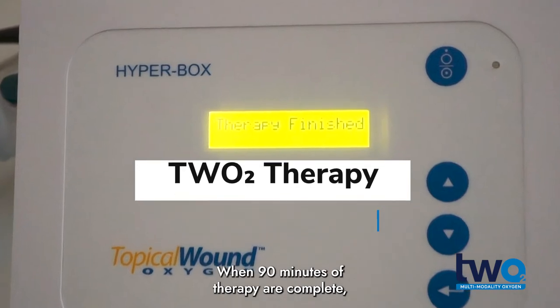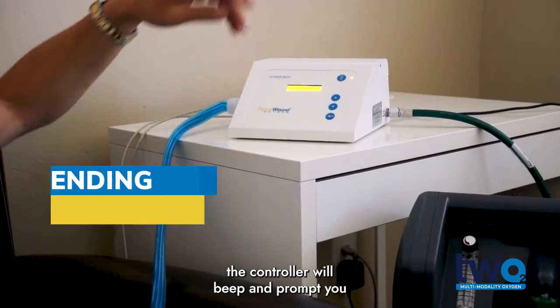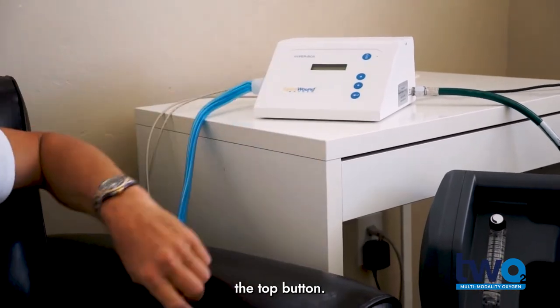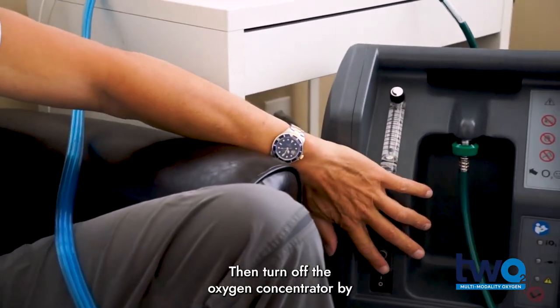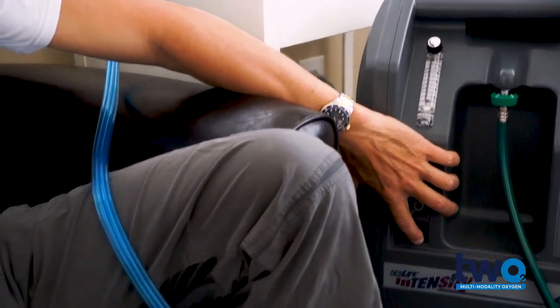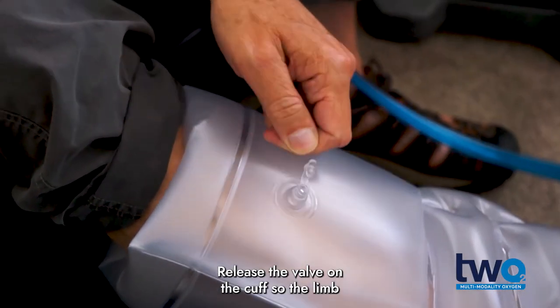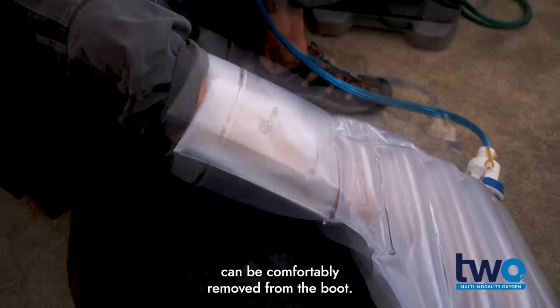When 90 minutes of therapy are complete, the controller will beep and prompt you to stop the therapy. Turn off the controller by pressing the top button, then turn off the oxygen concentrator by pressing the toggle button. Release the valve on the cuff so the limb can be comfortably removed from the boot.